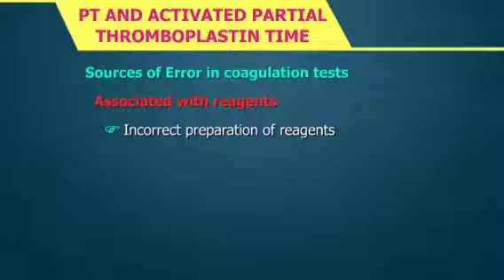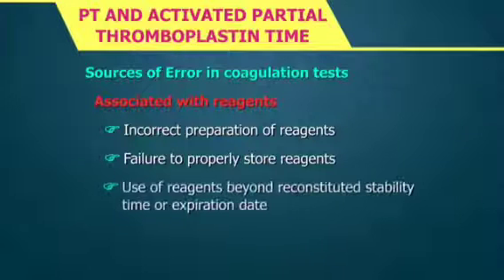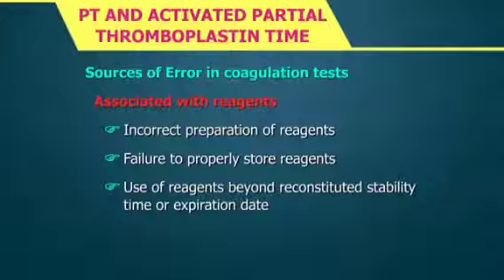2. Associated with reagents: incorrect preparation of reagents, failure to properly store reagents, use of reagents beyond reconstituted stability time or expiration date, contaminated reagents.